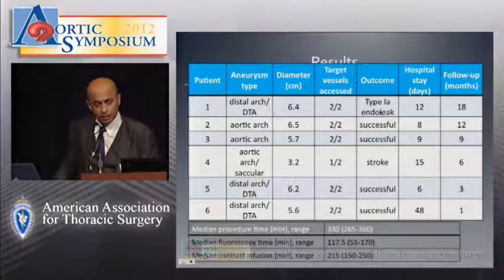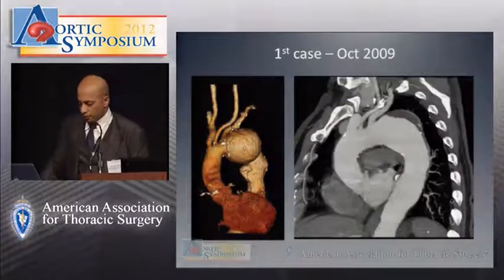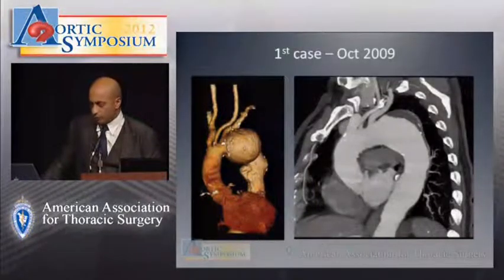The very first case, I'll go into some detail, had a type 1A endoleak, which we fixed. And the fourth case, I'll go into a little bit more detail as well. It ended up with a stroke, but fully recovered. So this was the first case that we saw.